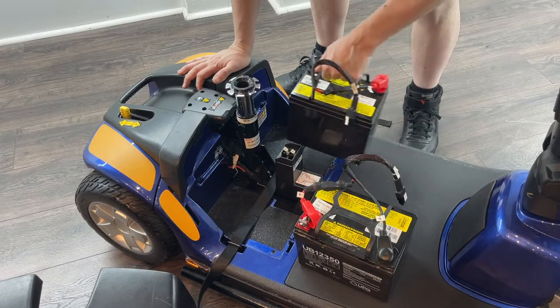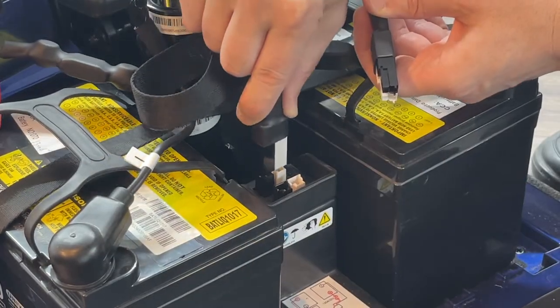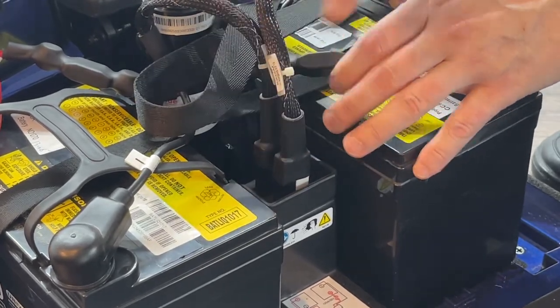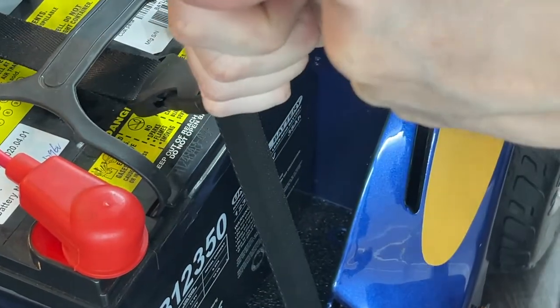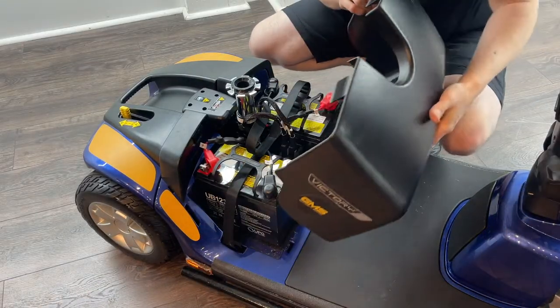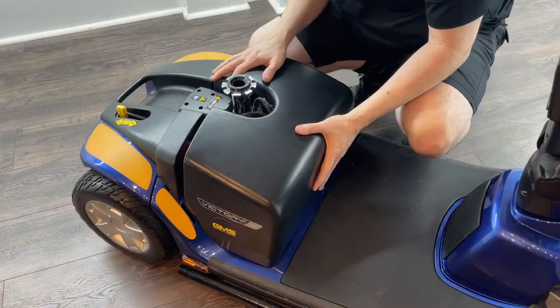Step three is to replace both of the batteries. Connect both batteries by grabbing the connectors, not by the wires, and insert them accordingly — black to black, white to white. Then it is very important to latch the battery's seatbelt tightly. Then replace the battery cover by inserting the tabs on the bottom into the floorboard and just laying it back.